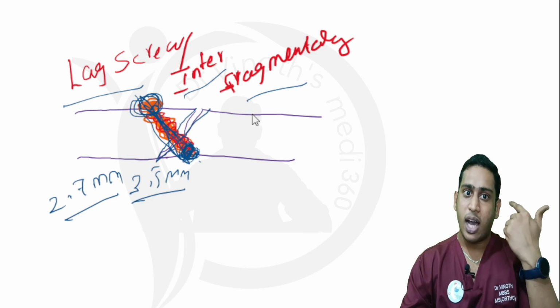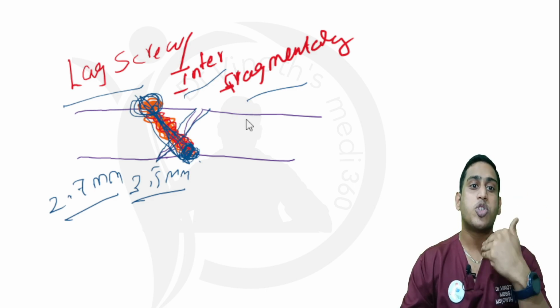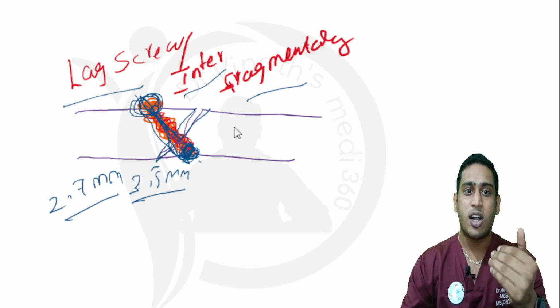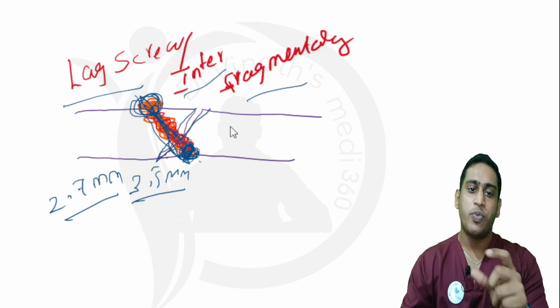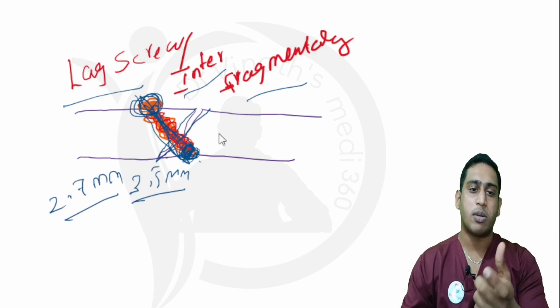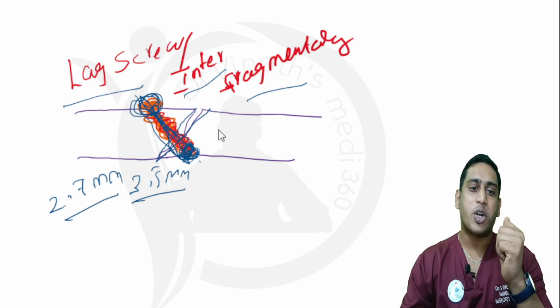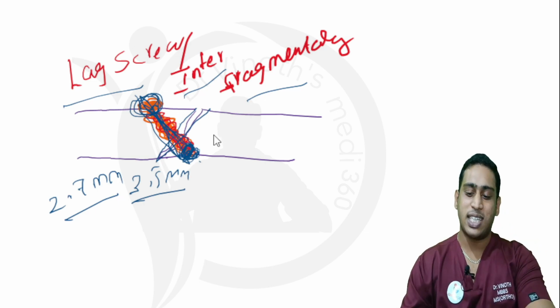I have already mentioned in plate fixation, whenever we apply a plate to support the lag screw, that is called a neutralization plate. So before application of the neutralization or protection plate, we need to apply a lag screw with a proper hold to compress the fracture site.